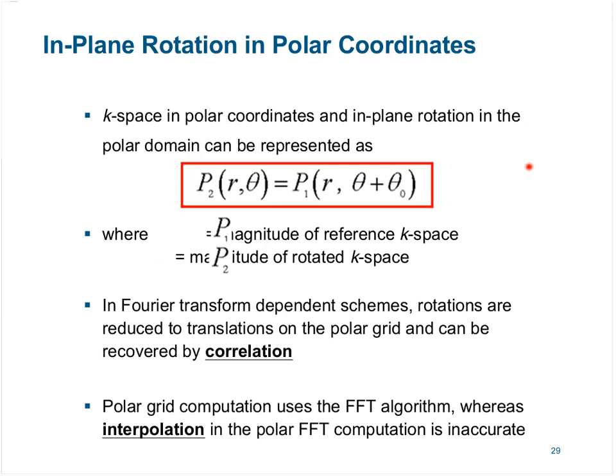And as I explained in the initial slide, two kinds of motion errors could be present in an in-plane motion case, and first is in-plane rotation.